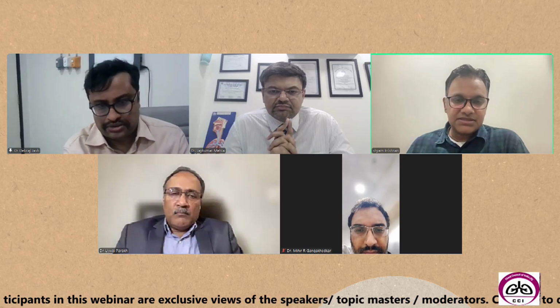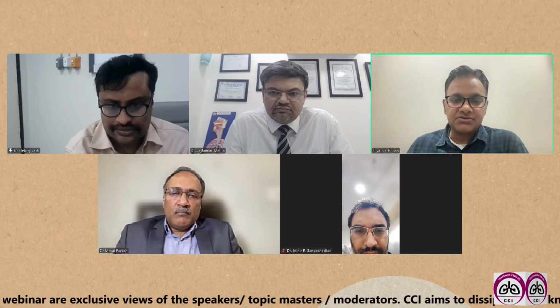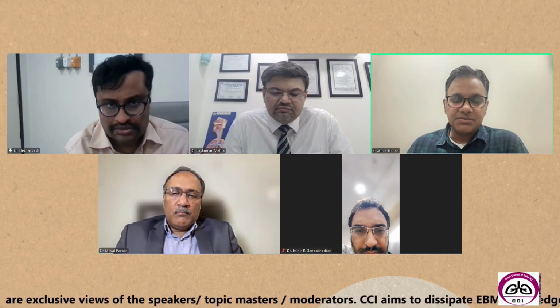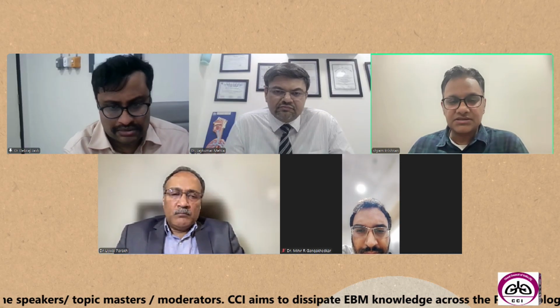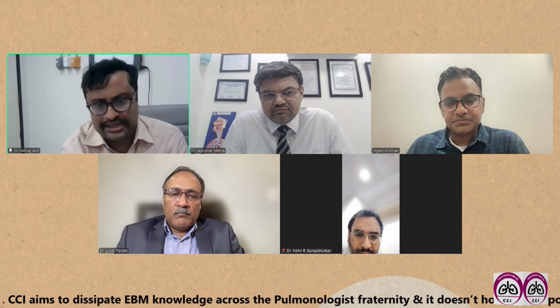Since it was taken out by the surgeon anyway, we didn't get to see the complications per se. Otherwise, I usually refrain from draining a cyst just because I see it, unless it's causing symptoms.